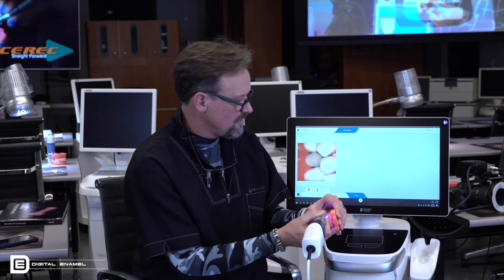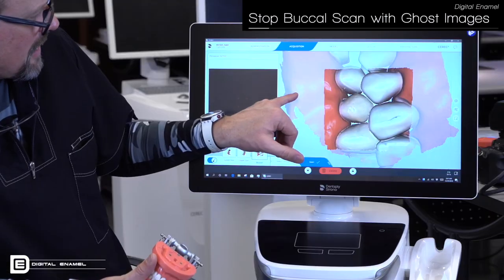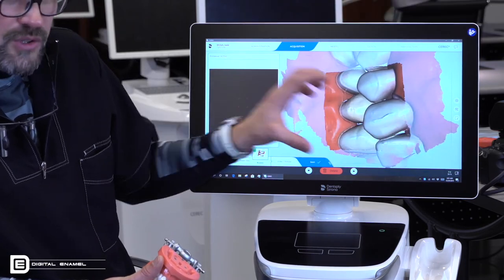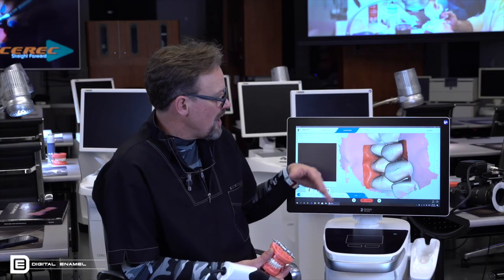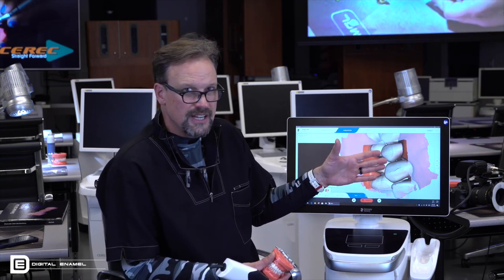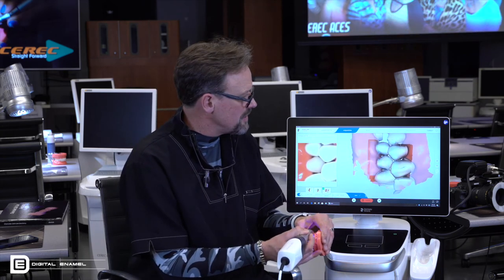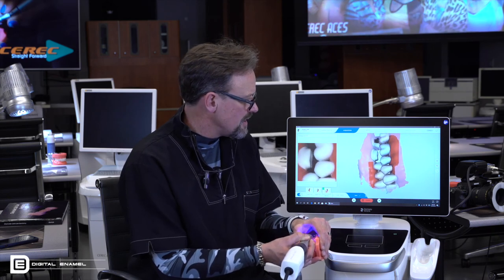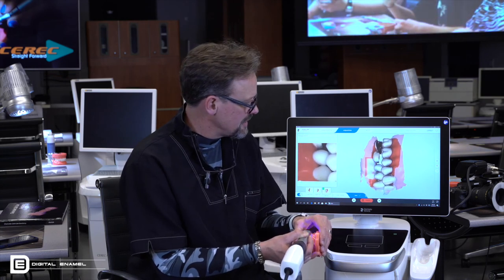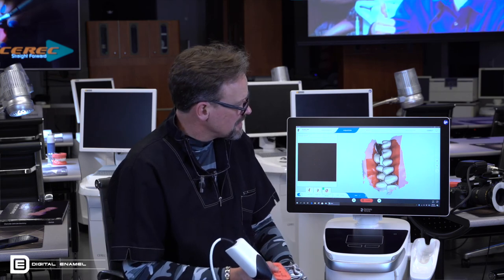I'm going to show it basically. Okay, look, that's all I need to do. I've got a ghost image of the lower. I've got the ghost image of the upper. Those two models are now articulated. I don't have to keep going and going. If I keep going, it's not going to articulate any better. In fact, you're just going to add a lot more data. So watch, this is what I see typically. The models are already articulated. You can do this all day long. They ain't gonna change. They're going to stay just like that, and I just added a lot more megabytes for no reason.